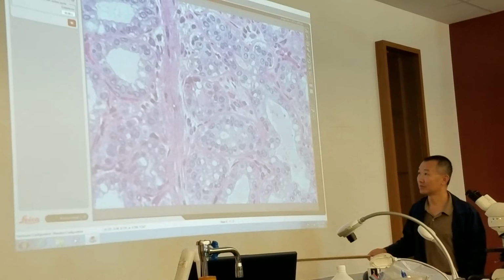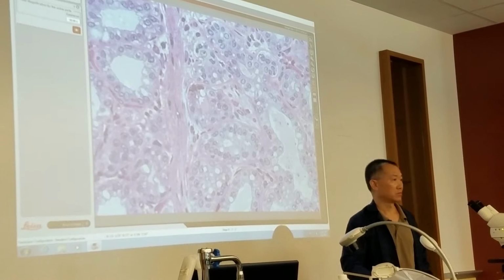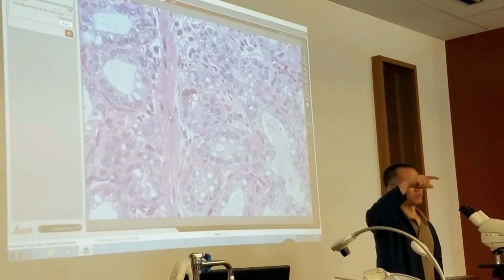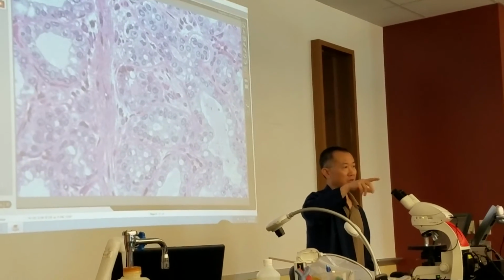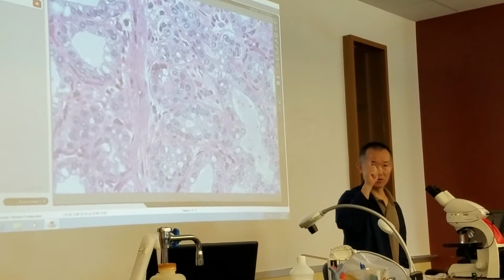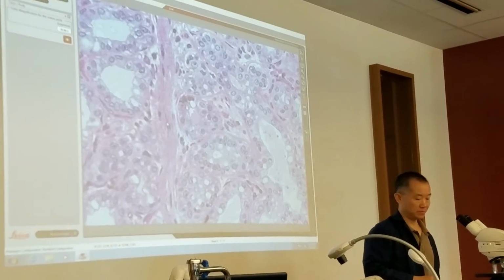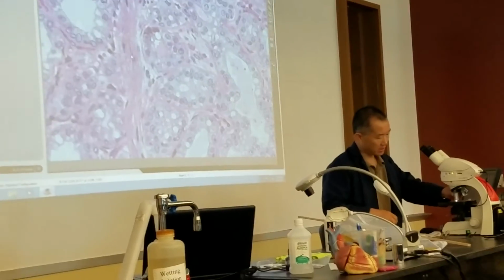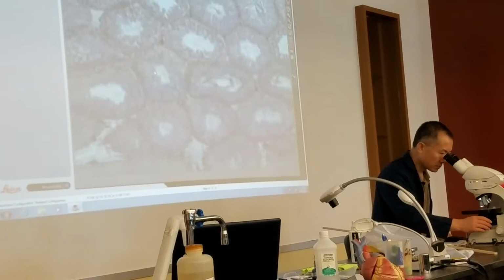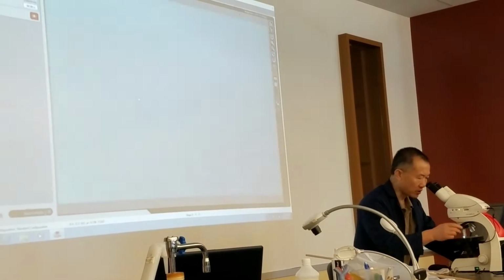Alright? Will you test us on that? The alveoli? Maybe. Mostly, for one slide we ask two questions. One asks you the stage, and then I ask you what the pointed structure is. 80% of the questions ask you what the pointed structure is. So the test is I'm going to test you at this magnification.